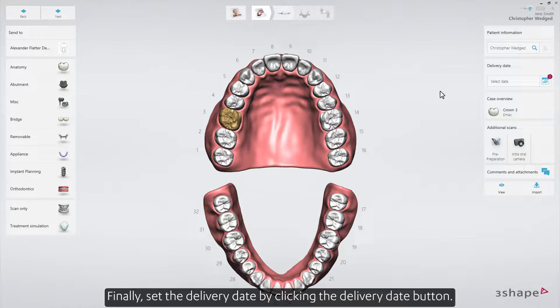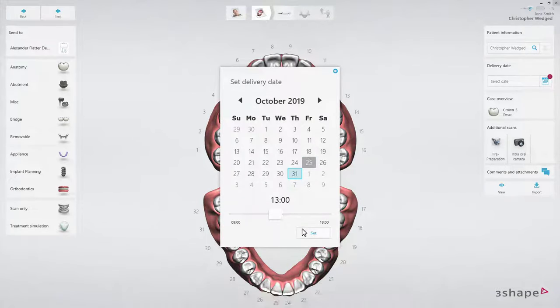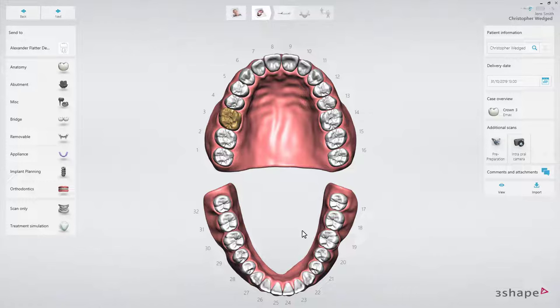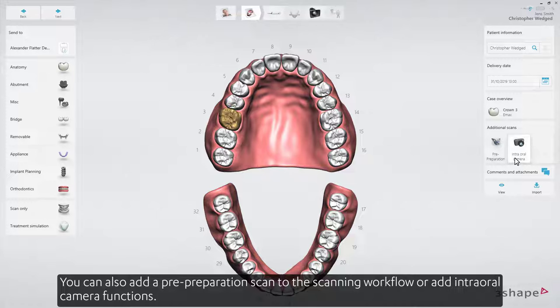Finally, set the delivery date by clicking the Delivery Date button. You can also add a pre-preparation scan to the scanning workflow or add intraoral camera functions.